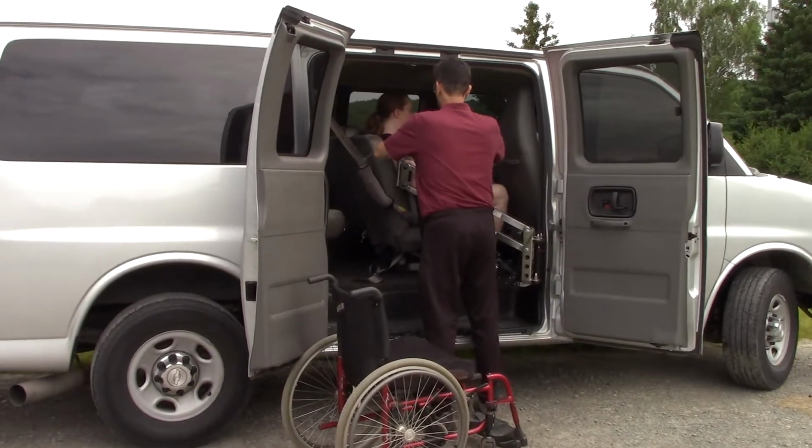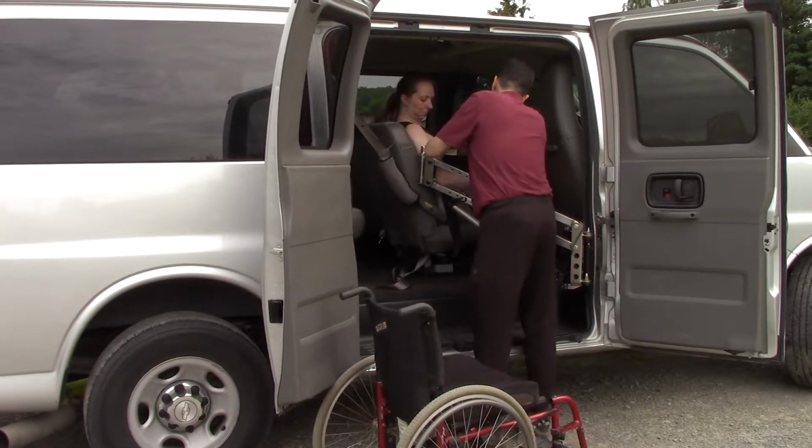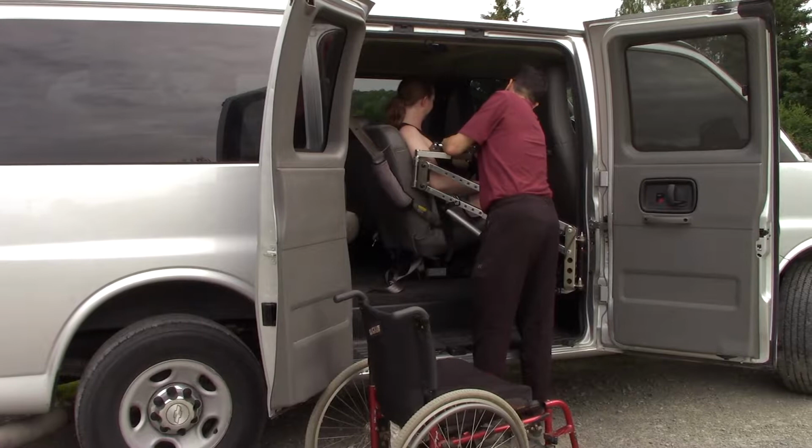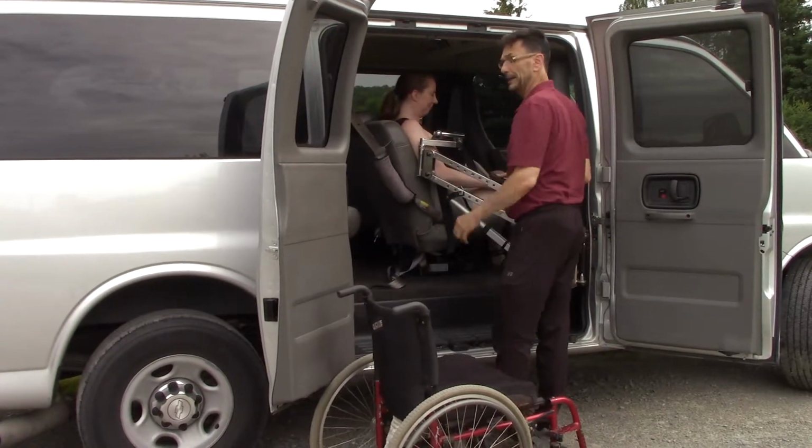So first thing we do is we connect the sling. Leg tabs first, arm tabs second. Raise.